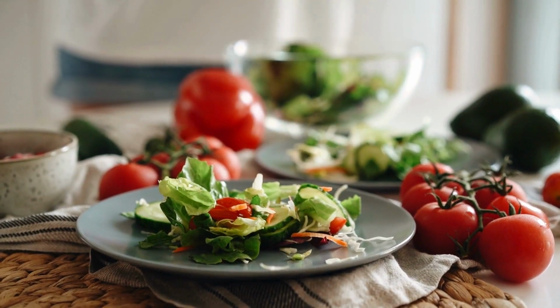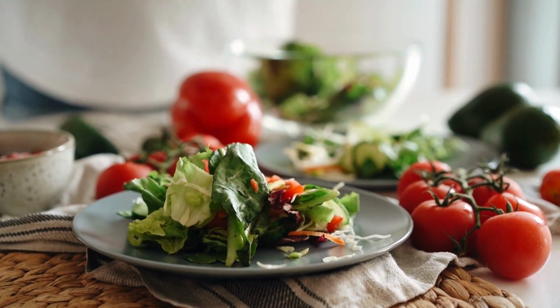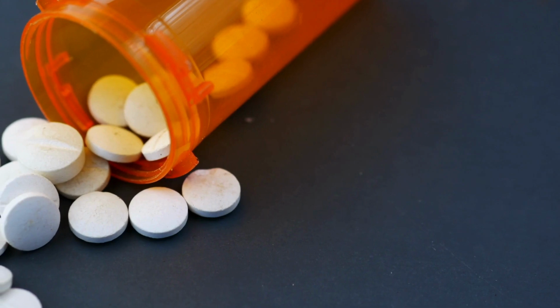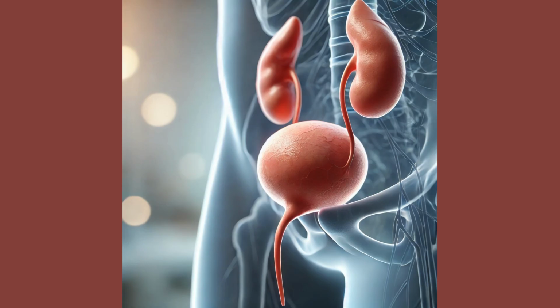Before the test, it's important to: 1. Eat and drink normally. 2. Take any routine medications unless instructed otherwise. 3. Ensure the patient arrives with a full bladder.